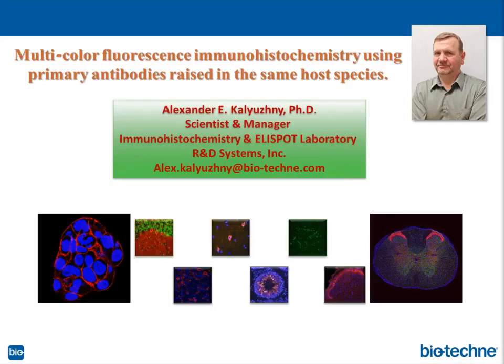It's not just the conjugation, that's the quality control that needs to be done on these antibodies, there's storage conditions, and pretty much it's a lot of work. That's why, just to cut costs of production, companies are not doing it often and may offer some antibodies conjugated to biotin, but that's a costly business which many companies don't want to go into.